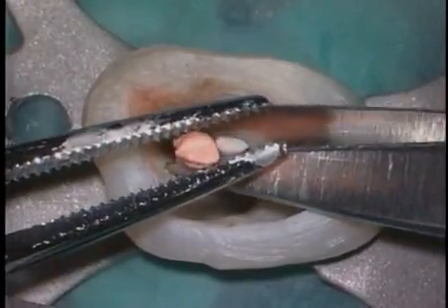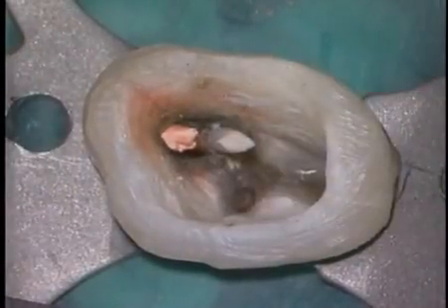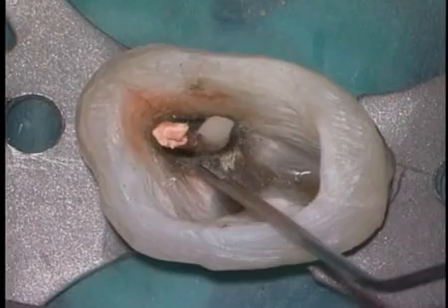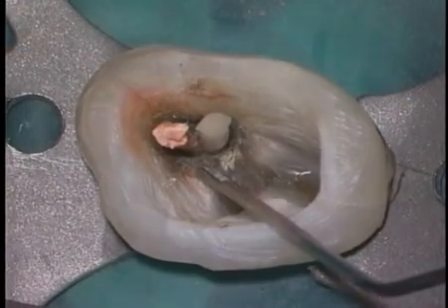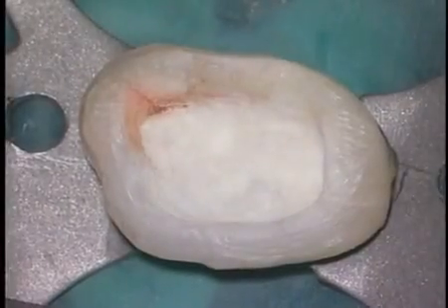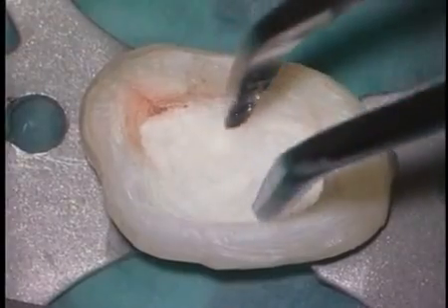We need to temporize the case, so we trim off the paper point and we can run water down the paper point again so that the MTA has water to drive the reaction to a brick hard set. The radiograph shows the master cone in place and an excellent repair on the lateral aspect of the root in the curvature. Anytime after 4 to 6 hours, the patient can be rescheduled.